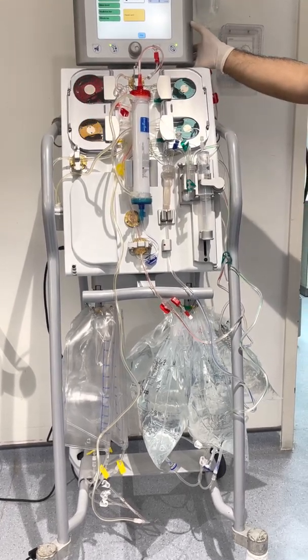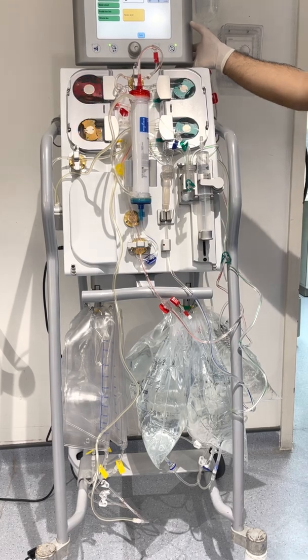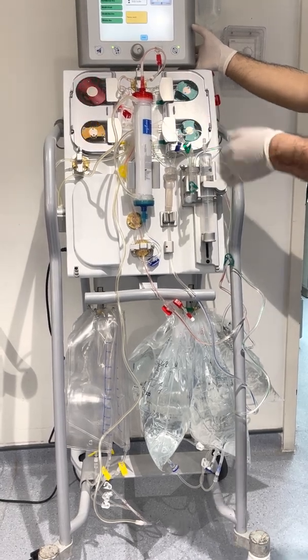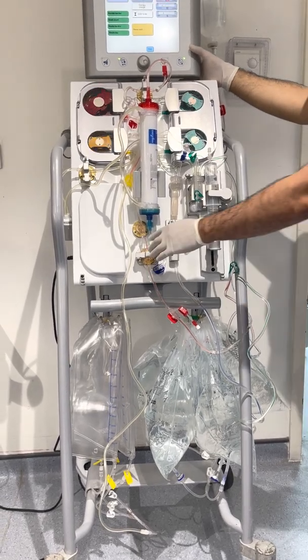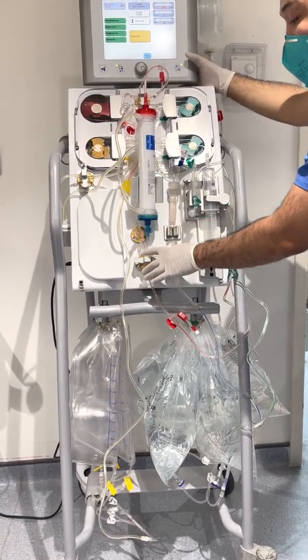So we advise, as per Dr. Madi, if you see some clots, do not return. It's better to blood transfuse than to put risk to the patient. And of course, it happened. It happened in our area.